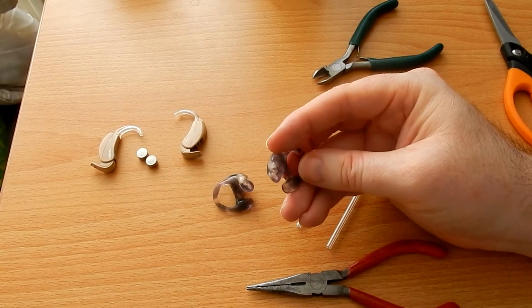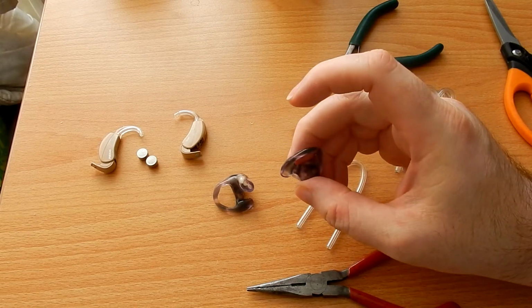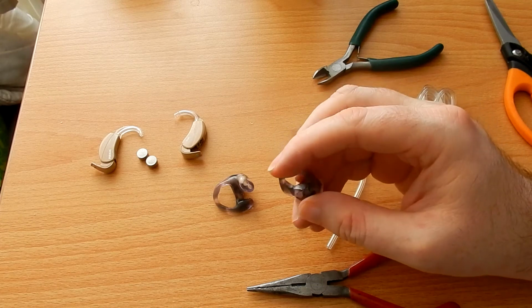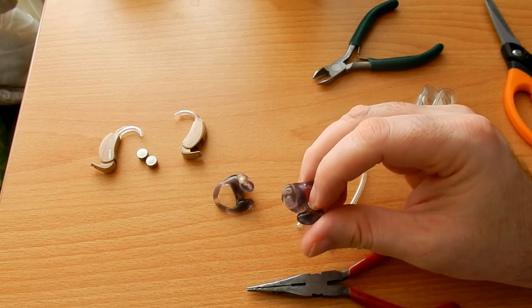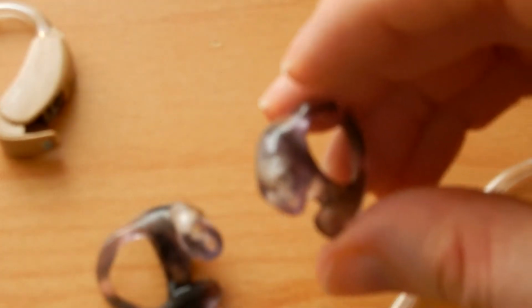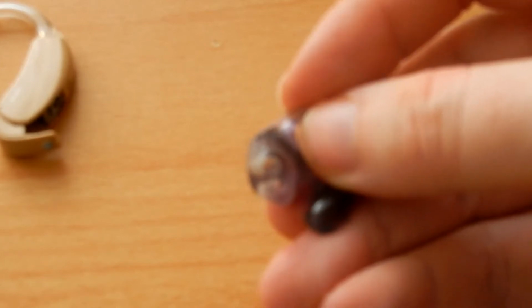Okay, what I've done was I took an old toothbrush and gave the mould a good scrub to get off all the crud that was built up on it. What you can see with the moulds, if I just zoom in, and hopefully it should focus.